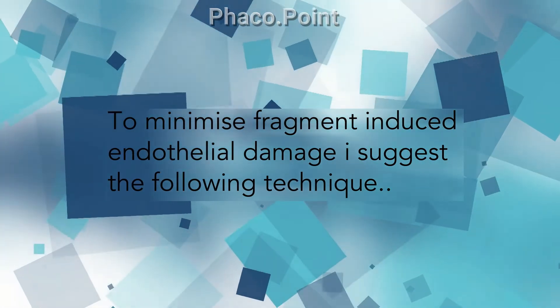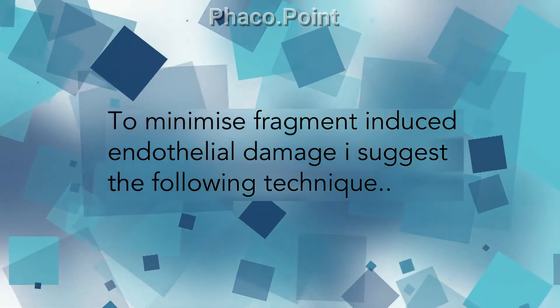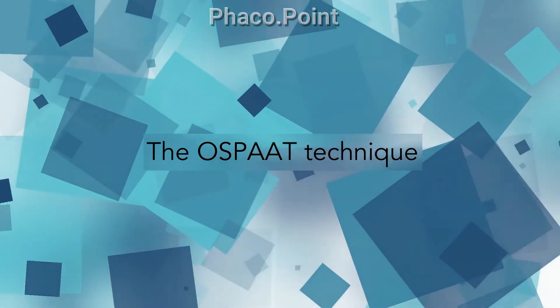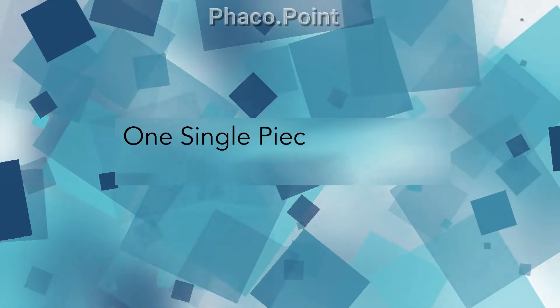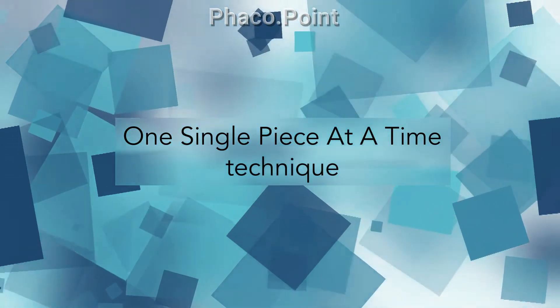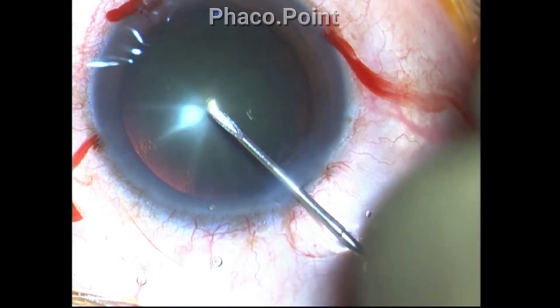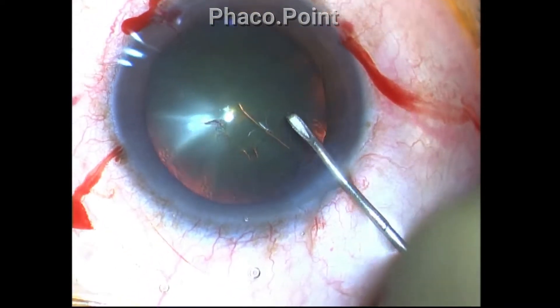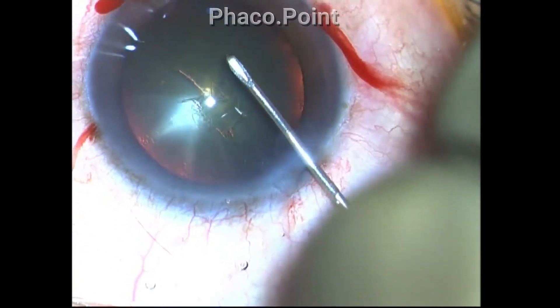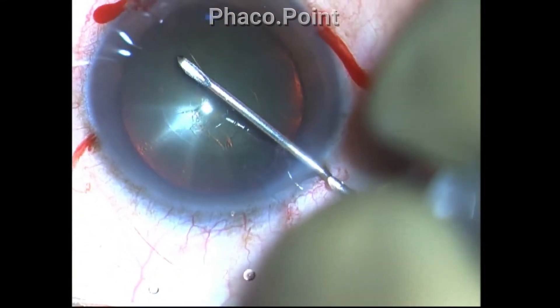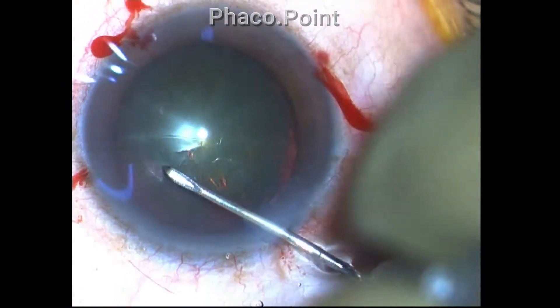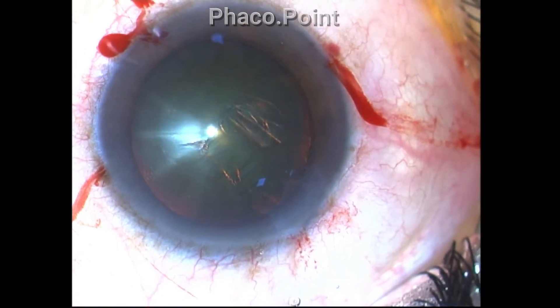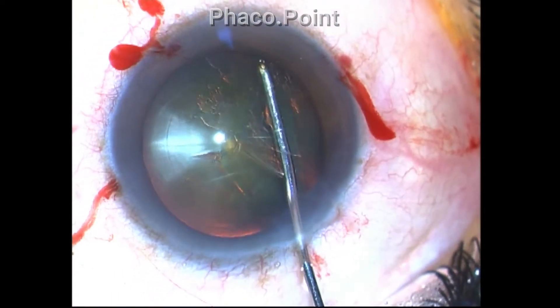To minimize fragment-induced endothelial damage, I suggest the following technique — I call it the OSPAAT technique, which is an acronym for 'one single piece at a time.' At the outset, do not aim for a large capsulorrhexis; keep it around 5 to 5.25 millimeters, even if you have a quite hard cataract like in this case — a grade 3 nuclear sclerotic cataract.